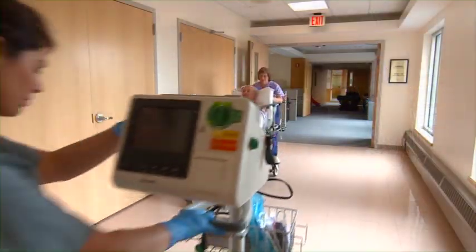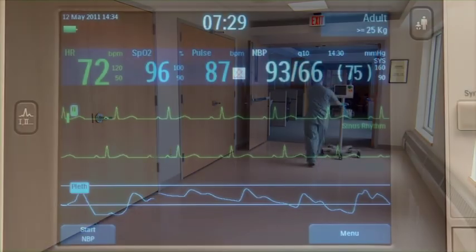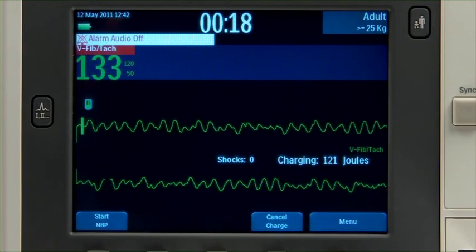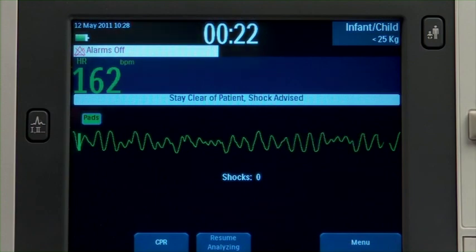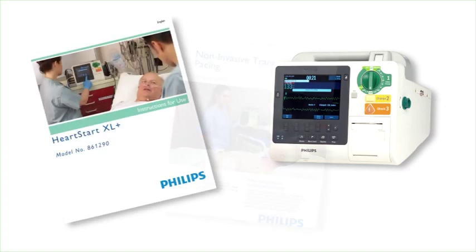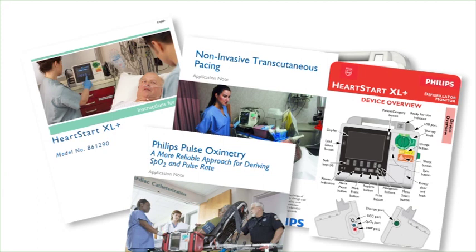No matter where you work, the XL Plus can be configured to meet your clinical needs. For this program, we'll demonstrate operation using the default configuration settings. Be sure to familiarize yourself with the device's configuration before using the XL Plus. Prior to using the XL Plus, you should also review the accompanying documentation, such as the instructions for use, for additional information about its operation.